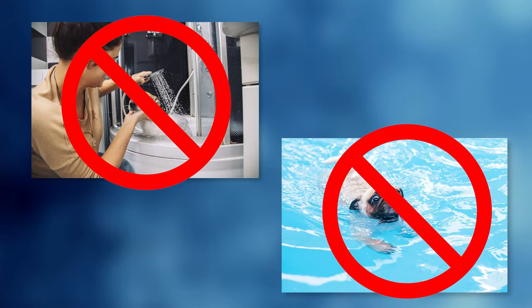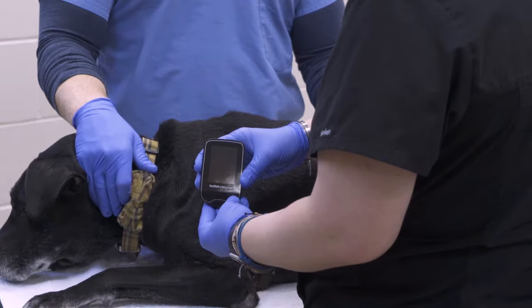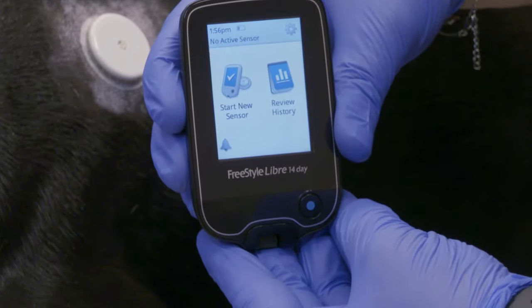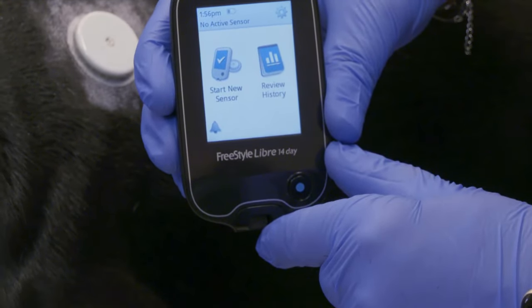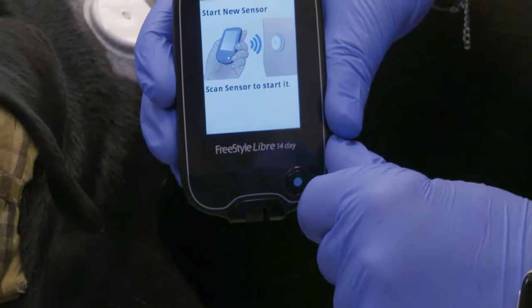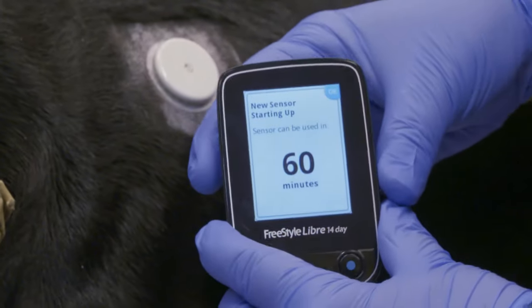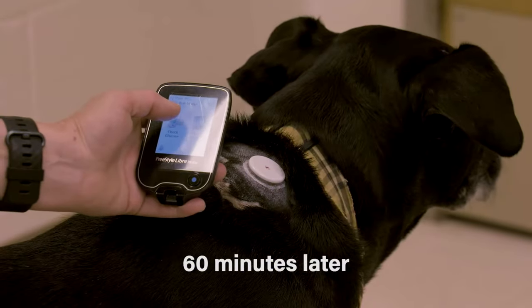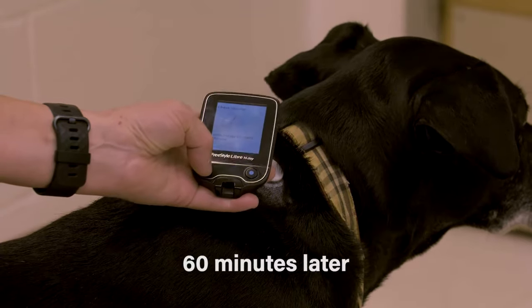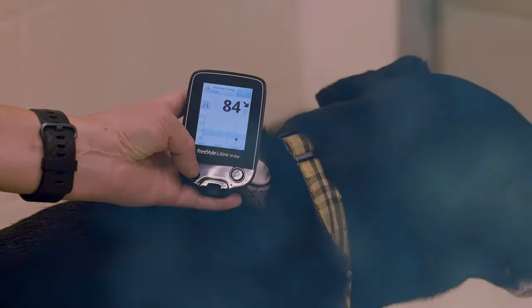sensor is in place. Once the sensor has been placed, switch on the reader and pass the reader over the sensor. When the reader scans the new sensor, it will detect the sensor and a Start New Sensor box will appear on the reader. After clicking on the Start New Sensor box, scan the sensor again and the reader will indicate that the sensor can be used in 60 minutes. 60 minutes later, scan the sensor again and the first glucose reading will be displayed on the screen.